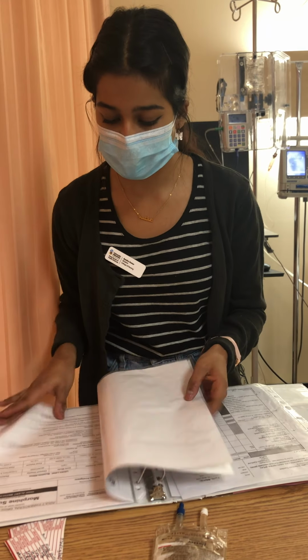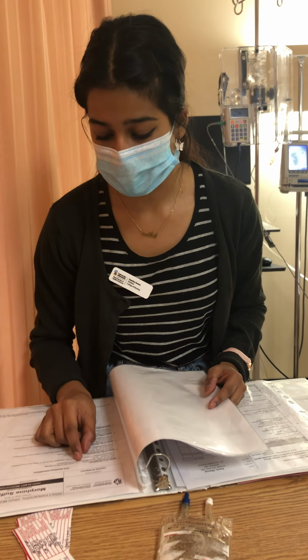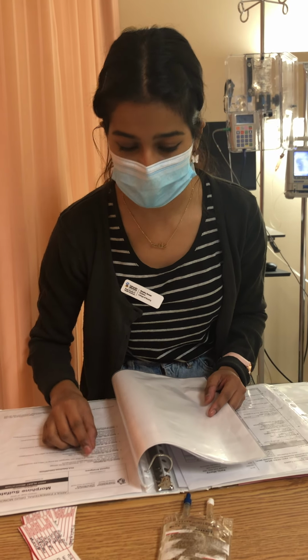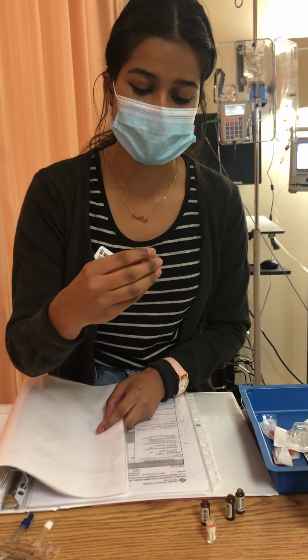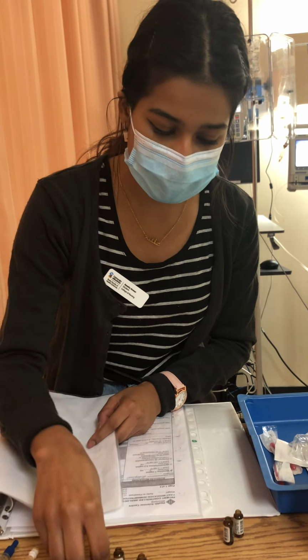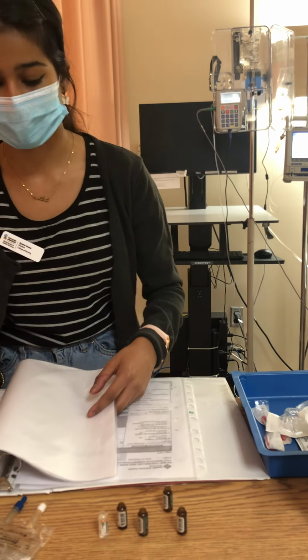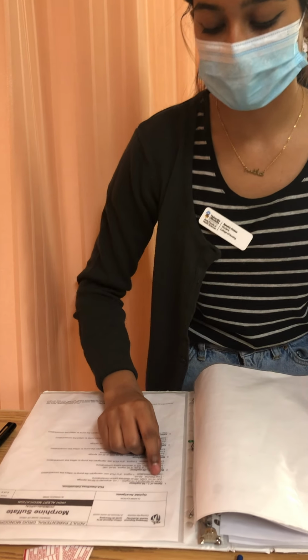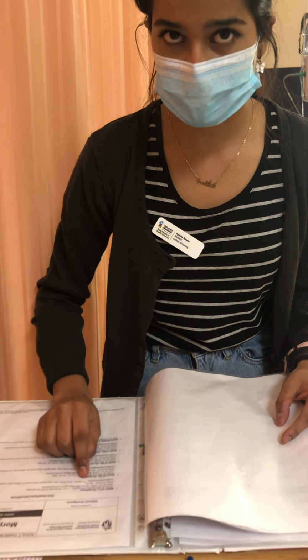According to the PDM, we are going to be drawing up 50 milligrams. So we're going to be using the 1 mil ampules that have the concentration of 10 milligrams per ml. We're going to be using 5 of those, so I have 5 of these, and I'm going to check the concentration of each of them to make sure it's the right one. So we have 10 milligrams per ml on each. So we have the right dose, and we're going to be mixing it with 45 mils of normal saline, which I have, to get a final volume of 50 mils and a final concentration of 1 milligram per ml.